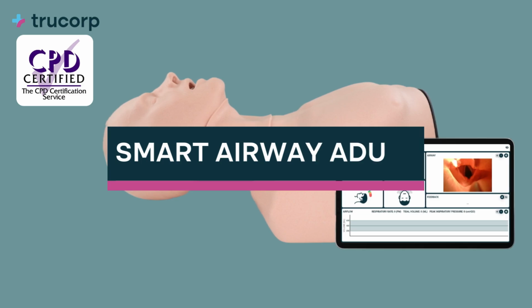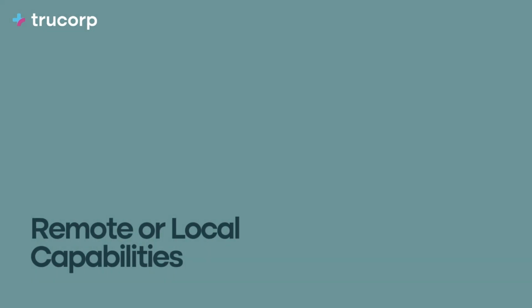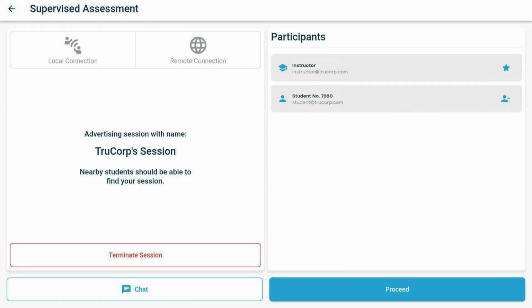The Smart Airway Adult incorporates smart features and sensor technologies to provide real-time feedback to users training in airway management. The Smart Airway app includes 3 training modes. The Instructor-Led Assessment.